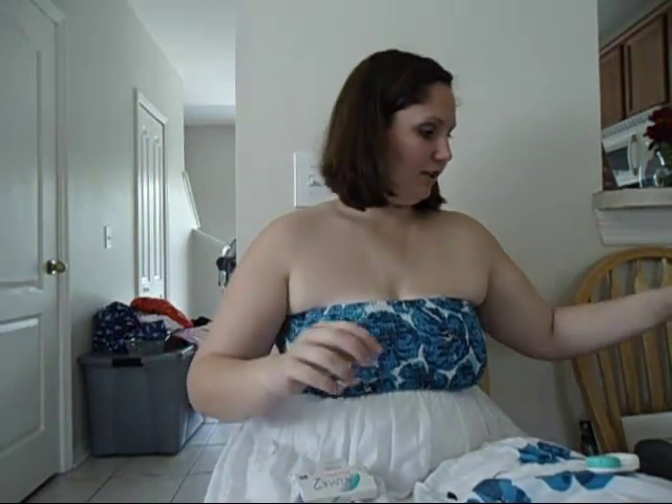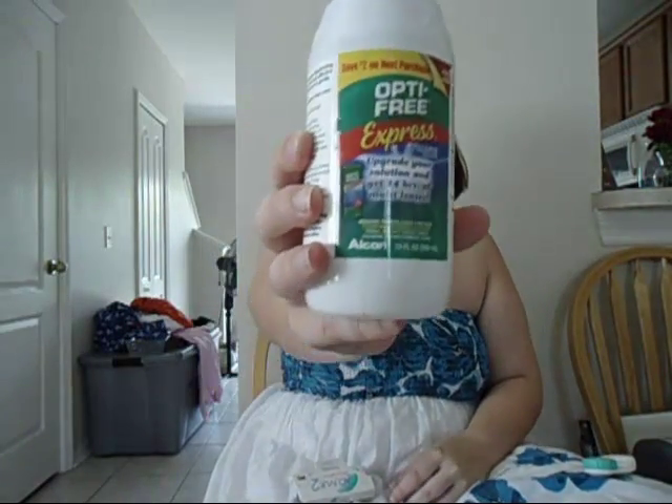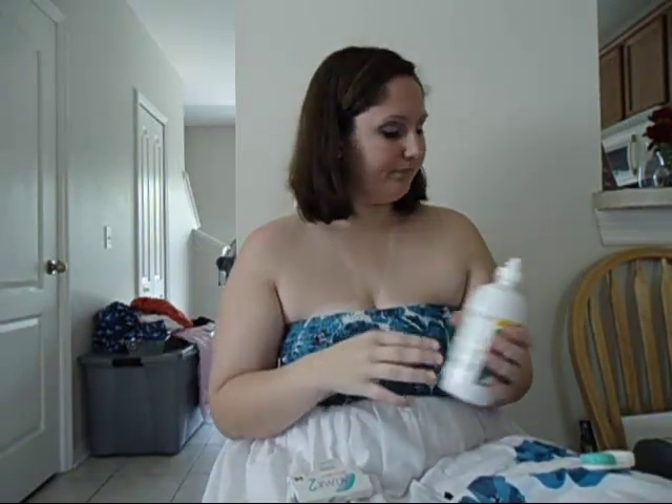Once you take the contact out of the little case, you want to take your contact solution — I use the Optifree Express. You're going to take your contact between your two fingers, pour the solution over your contact, and just lightly make sure it's clean. Then once you're done cleaning the contact, you're going to place it on your finger, bowl up, and then place it in your eye.